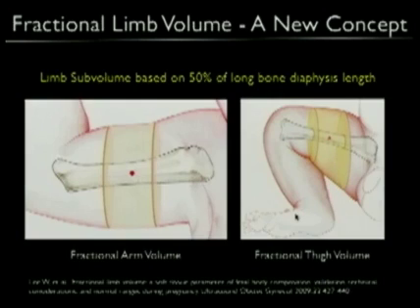And the normal ranges and the technical considerations have recently been published in the April issue in the White Journal 2009, as shown here.